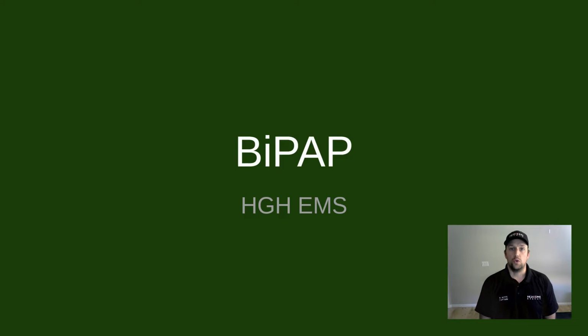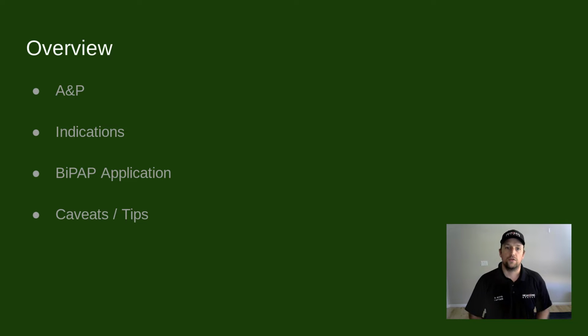In this video, we'll review BiPAP for the Hamilton T1. For the overview, we'll look at a very abbreviated anatomy and physiology, a generalized indication for BiPAP, how to actually apply the BiPAP, and then some quick caveats and tricks.